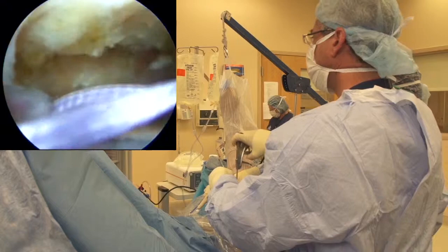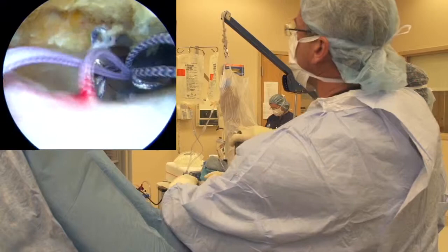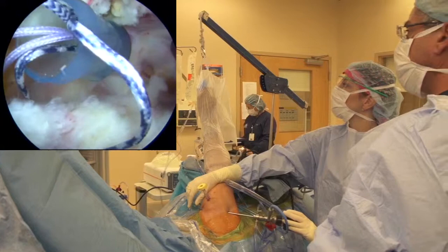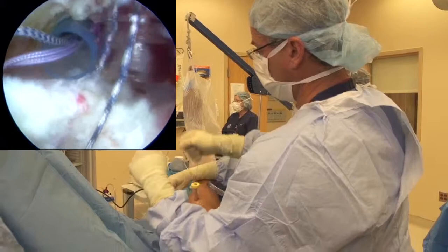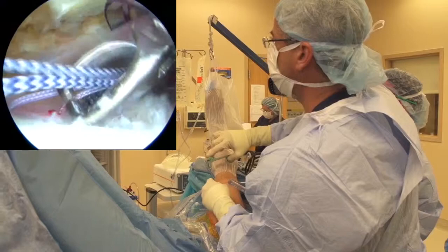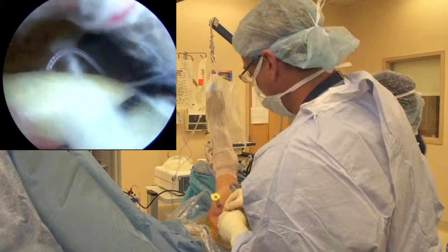Suture management is key. Making sure we're not grasping our biceps underneath - we carefully looked at that as we passed. We'll see if we can get one more in. At this point, what I may do is just do a simple stitch on the front here for this one since we're running out of real estate, then clip that off and tie the rest of our medial row. We'll go ahead and tie this simple stitch down. Standard knot tying technique. Already closing down very nicely. Not too concerned about knot impingement with a single knot. We're already covered over our footprint very nicely by taking the tension off with our anterior single stitch technique.